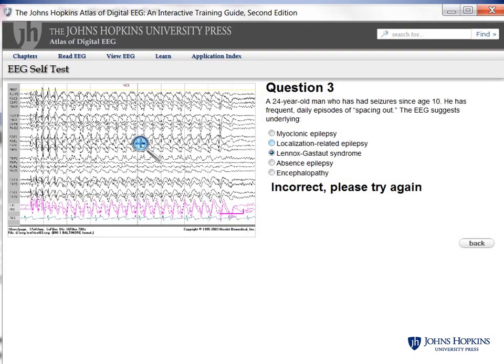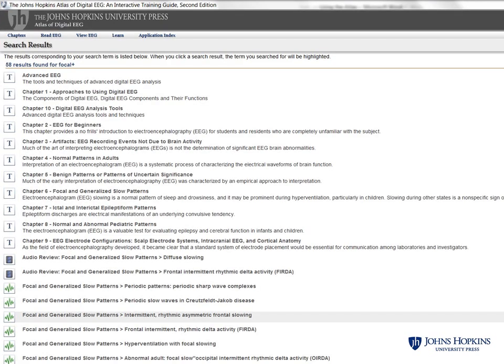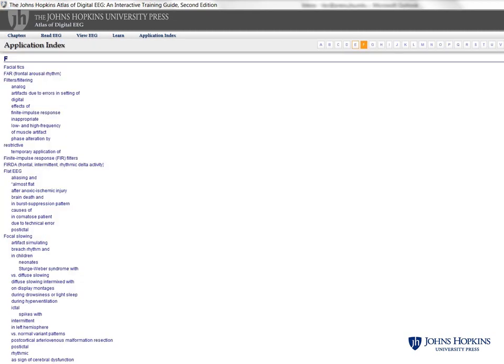The EEG self-test allows users to measure their progress and identify topics requiring further study. Use the search function to find specific topics of interest; results are categorized by media type and linked. The application index is another easy-to-use tool that quickly links users to topics of interest.